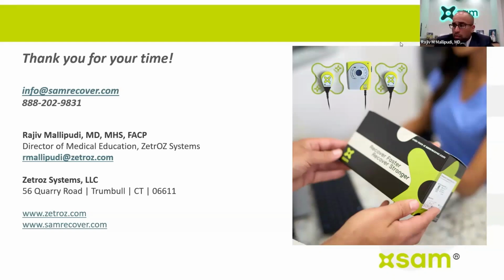We also don't recommend it for anyone with any blood cancers. It shouldn't be used if the patient has deep brain stimulation or a pacemaker, or any type of ischemic tissue, severe peripheral vascular disease. We wouldn't want it to be used, particularly because if you have peripheral vascular disease near your toe and you're using it near your ankle, there's less blood flow there, so you're going to have less blood supply. It's unable to meet the increased metabolic demand. You could have some necrosis, so we would avoid that as well.